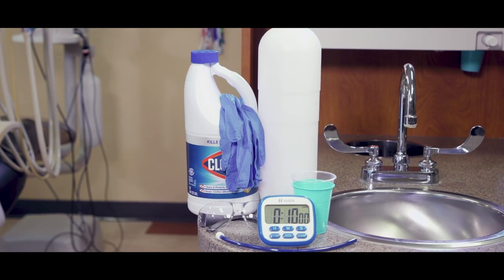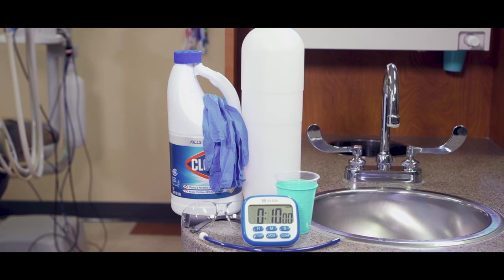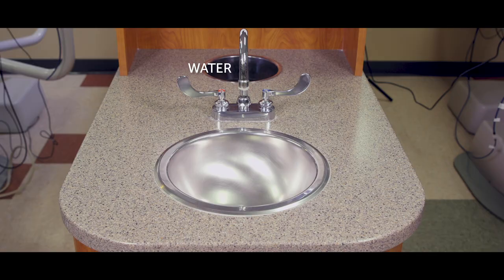ProEdge recommends bleach because it is highly effective in just 10 minutes. Several dental unit manufacturers have authorized the use of diluted bleach in their water lines, including these guys. But if your practice is not comfortable using diluted bleach, we've seen some good results with other products. Follow your dental equipment manufacturer's instructions and call ProEdge if you want some guidance. Let's get started — we've got our materials here, nothing too complicated.